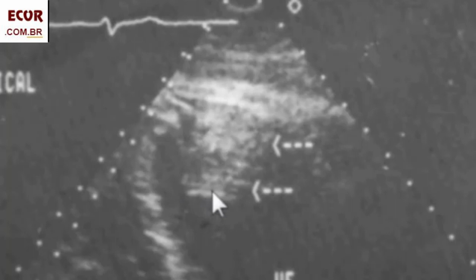If this were a thrombus, it would be located at the same depth as this wall and would have the same displacement. Then, this distance from the thrombus and the wall would be maintained. For instance, if we move the transducer to this place and this were a thrombus, that distance from the wall would be maintained, since it would be a real structure at same depth.